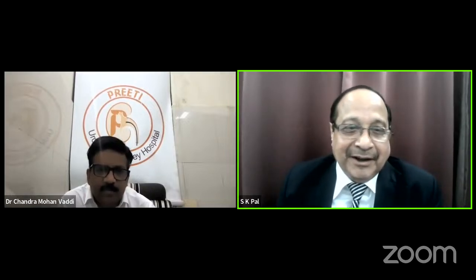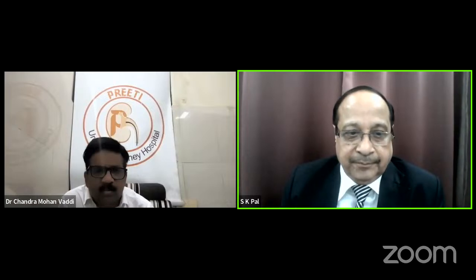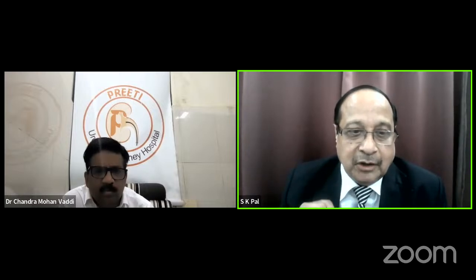Chandra, this statement of yours speaks volumes of your experience. Whatever you have said is absolutely correct. I agree to that. The 12 French nephroscope, although it is being sold right and left these days and everybody is talking about it, the vision through that and the irrigation, if you don't pass any instrument, irrigation is very good. But as soon as you pass even a 0.8 French laser fiber, a lithoclast probe, or a pneumatic 3 or 4 French probe, forceps.